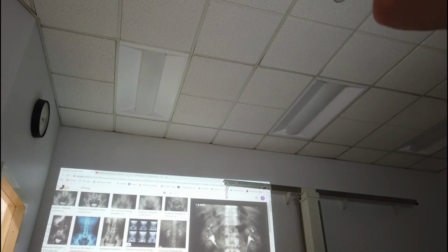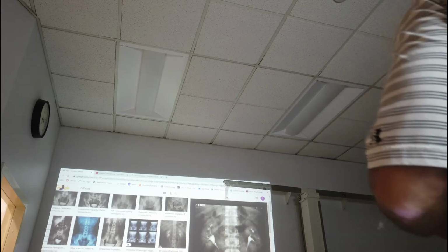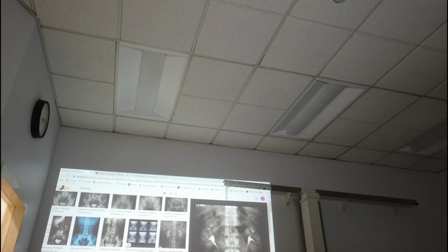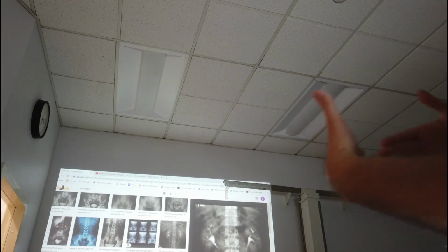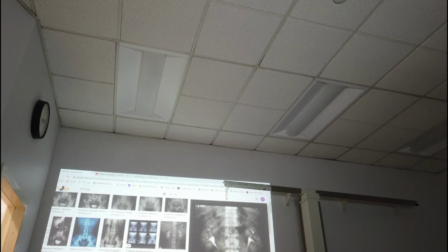So we're always looking at the opposite ureter. If you put the patient in an RPO, it's going to show the left kidney, but the right ureter. So we're looking at the upside kidney, downside ureter, basically. If that makes any sense.